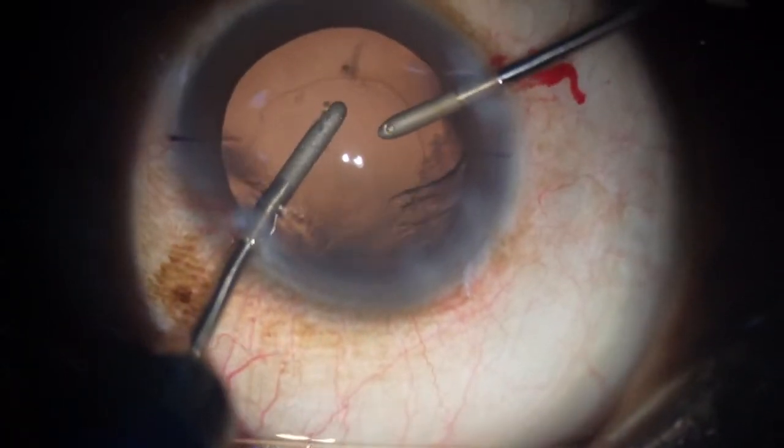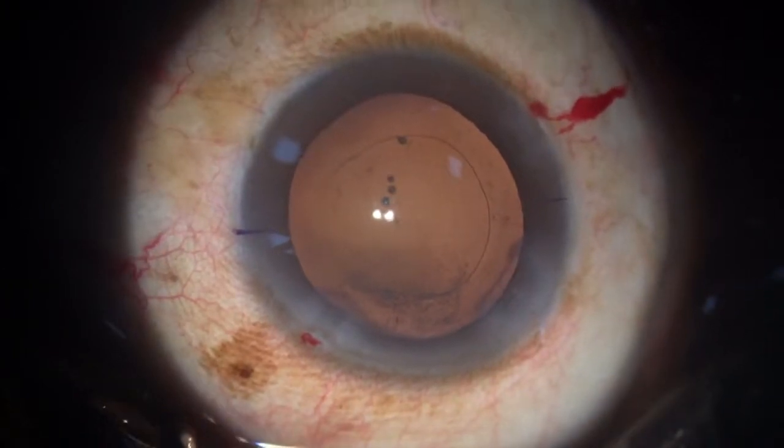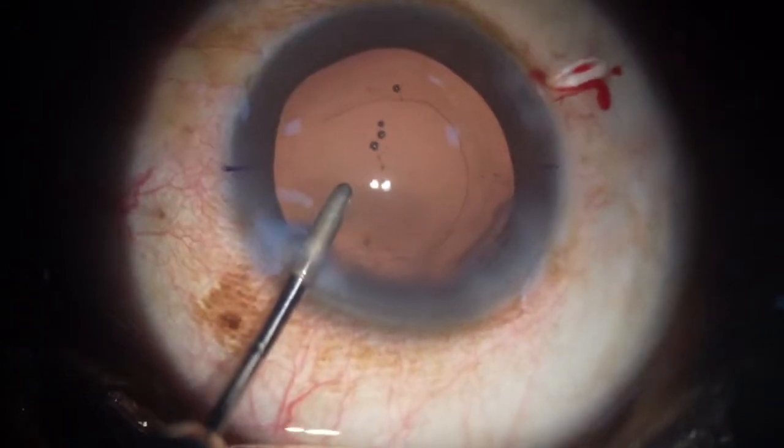So the good thing is, if you'll notice here, my infusion is going, and I can just remove it very effortlessly without having to go aspirate it. You can just, I call it a hydro jet polish or whatever you want to call it.